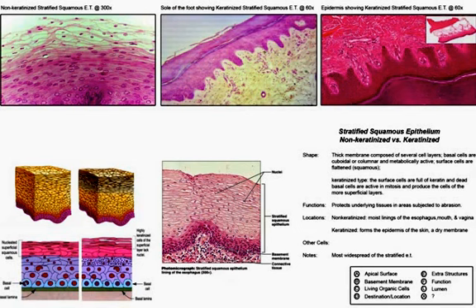These two cell layers are, again, thick skin. This is in moist body openings. The next slide that we look at will show these two separately.